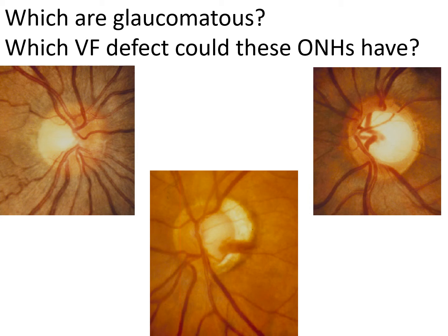For instance, in the first image on your left, you see a healthy eye. You see a very well defined retinal fiber layer all around the optic disc. You see a pinkish and wide rim and a small excavation. In the image in the center, we have a hemorrhage in the inferotemporal sector.